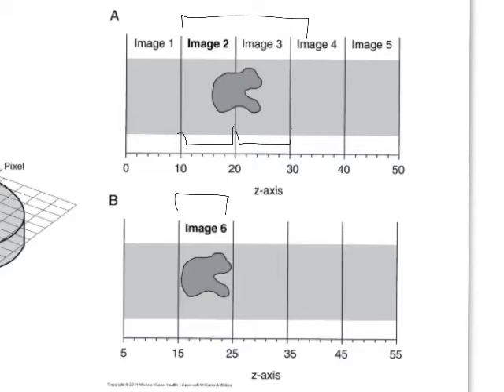As we decrease the slice thickness, we will decrease volume averaging, but guess what? Patient dose goes up. A ton. This is a significant issue with CT right now, this tension of how do we get a good volumetric data set without giving everyone cancer that gets a CT scan. That's a big concern any time we're treating cancer, right? Is the treatment just going to cause more cancer, more problems than just leaving it alone?